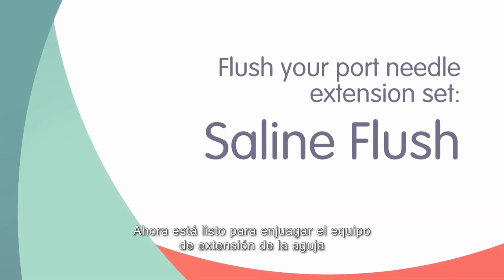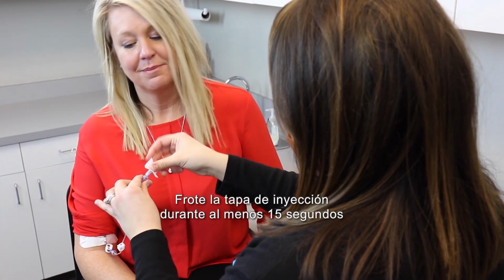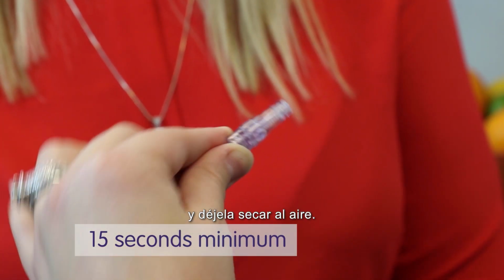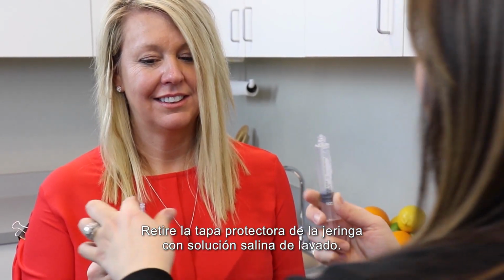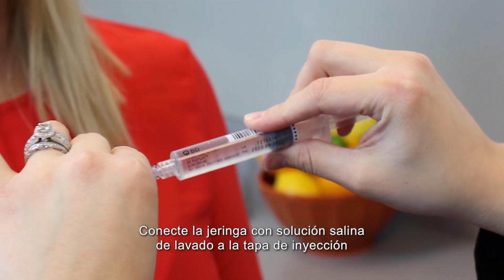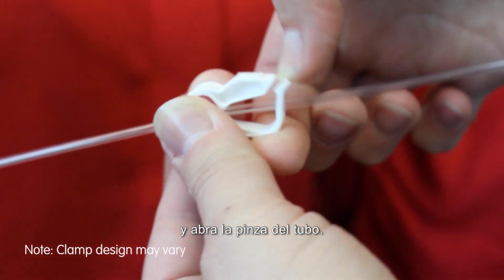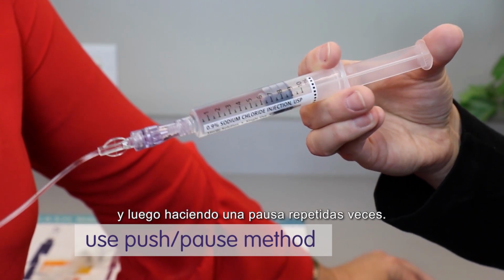You are now ready to flush the port needle extension set with saline. Scrub the injection cap for at least 15 seconds and allow it to air dry. Remove the protective cap from the saline flush syringe. Attach the saline flush syringe to the injection cap and open the clamp on the tubing. Flush tubing using a push-pause method.